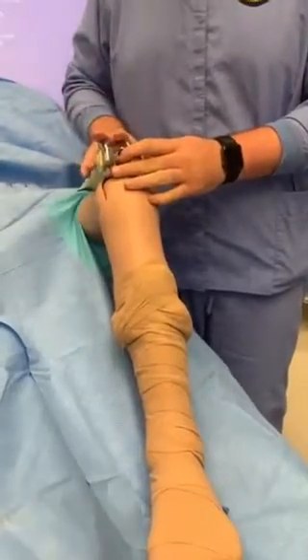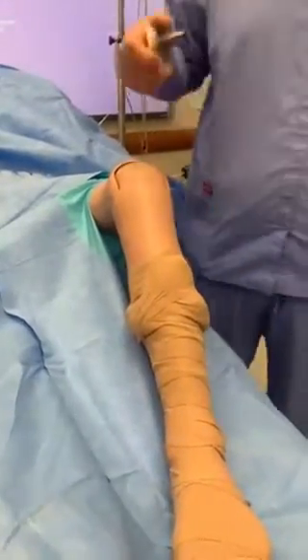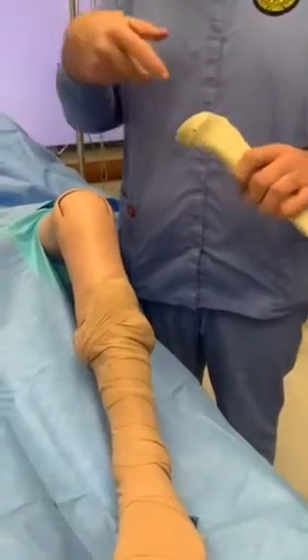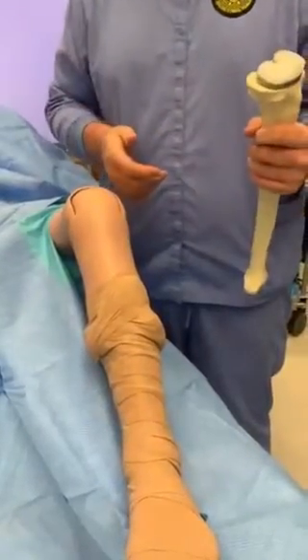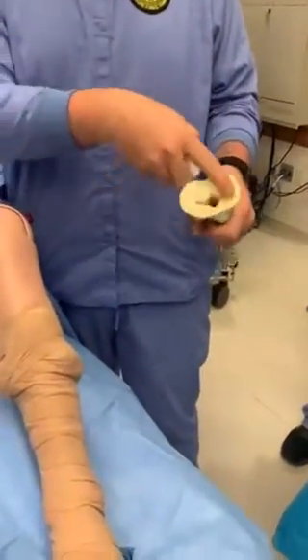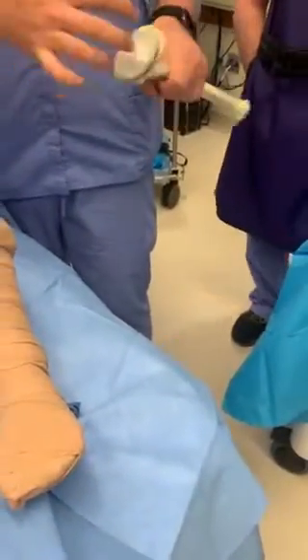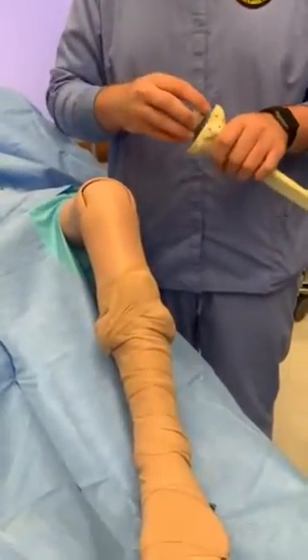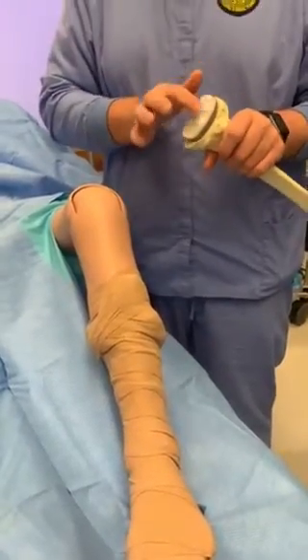Once they have the femur done, they'll move to the tibia — same thing, cutting block over it, and that's just one cut straight across to make it flat. Another hole down the tibia allows them to place the implant in there. Usually the implant fits exactly to the size of the tibia; this one's a little small as you can see. They'll have different sizes so it fits exactly, and they'll determine the size spacer they need, which corresponds with the size of the implant that goes on top.